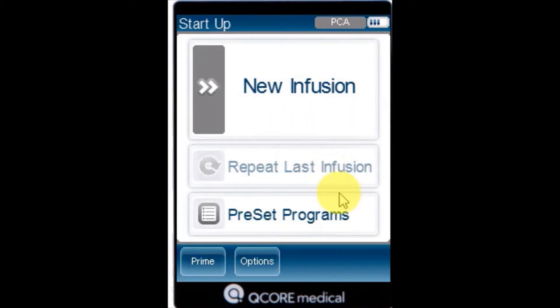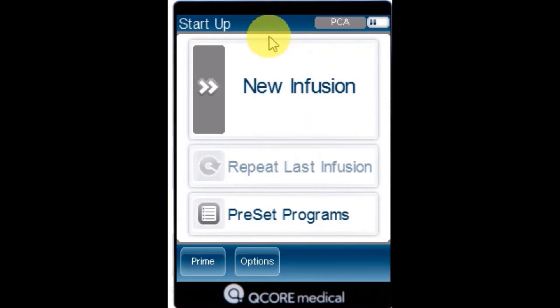To begin a new PCA infusion without a drug library, from the indicator bar, verify the pump is in the PCA mode. From the startup screen, select New Infusion.